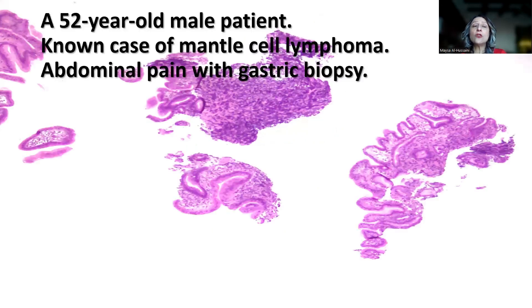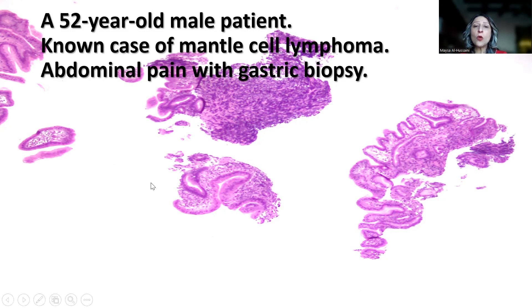This is a case of a 52-year-old male patient who is a known case of mantle cell lymphoma. He started to complain of abdominal pain, for which he underwent upper and lower endoscopy and obtained a gastric biopsy. As you can see here from the low-power magnification, several fragments of gastric mucosa, one of which showed this lymphoid aggregate.